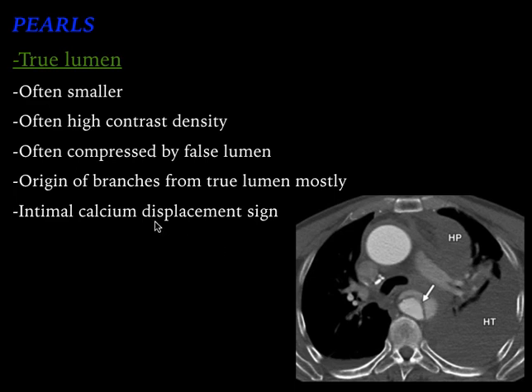Another important sign is the intimal calcium displacement sign. You can see here a small speck of calcification that is displaced — it should be located at the intima but has been displaced internally. This is called the intimal calcium displacement sign. These are the characteristic features to look for to identify the true lumen.